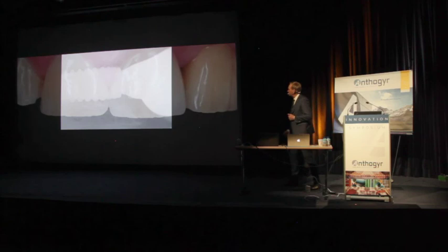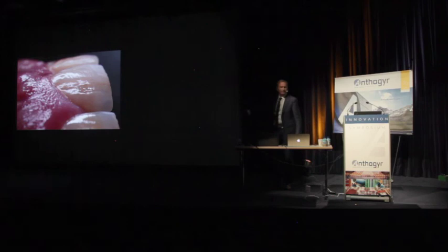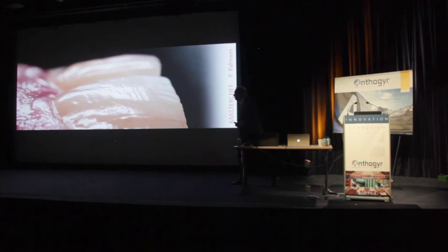And so this is again a crown with hand-polished texture. And it really looks like a natural tooth. You see the light reflection, and therefore it's also teamwork. You need a good technician to finish the job and to make a good looking tooth, not a crown.